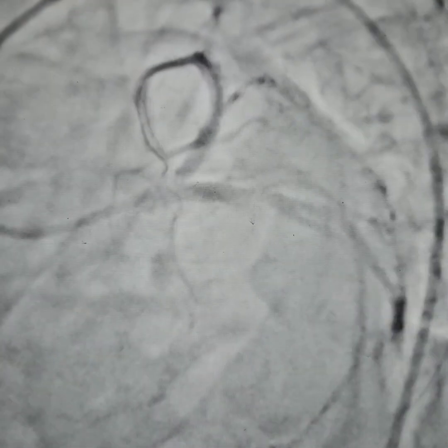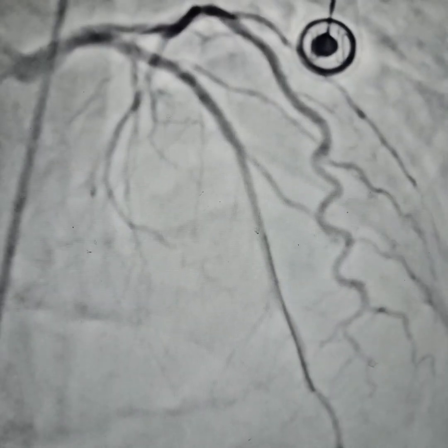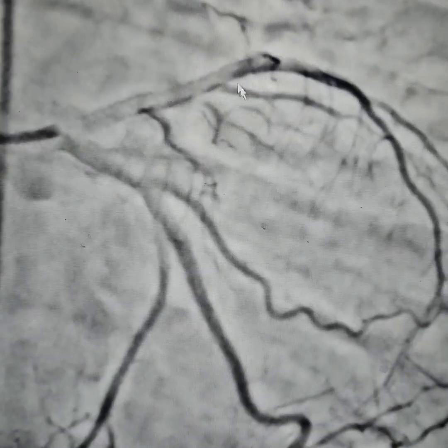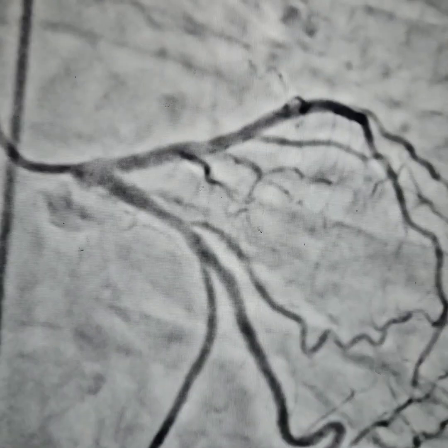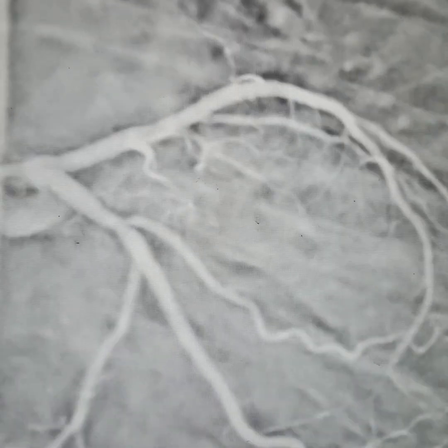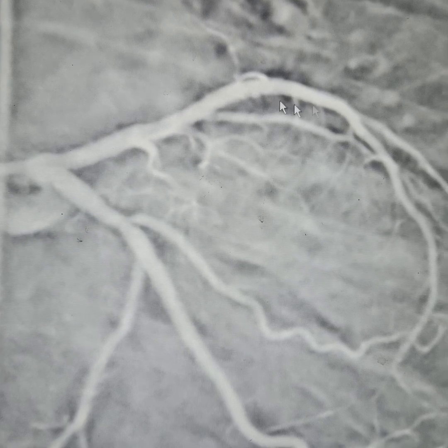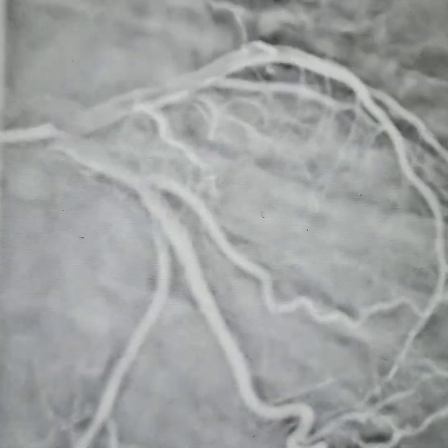We are doing aggressive post-dilation and we will see a very good result. Always remember that post-dilation is a very crucial step, and using stent boost or IVUS is very important. The result is quite good and we are happy with it. The patient had relief of chest pain. The most tight segment is now quite well and fully expanded — you can see how beautifully the LAD has opened. The stent has done wonders.